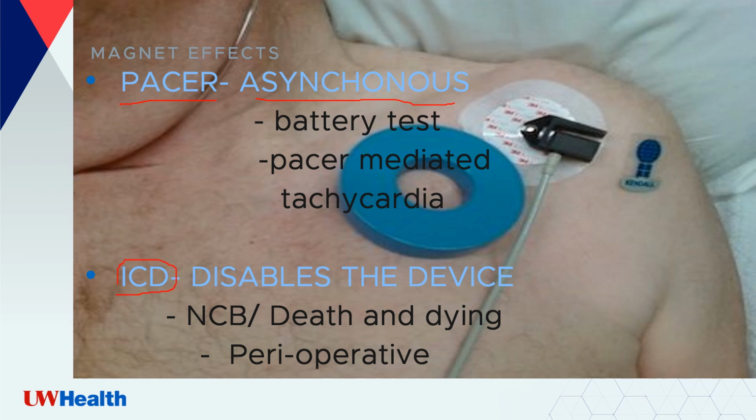ICDs, on the other hand, if we utilize the magnet, it's going to disable that device. You can see there's a clear difference between the two. You might see this with a no-code blue patient, death and dying patient, or utilized in the perioperative services.